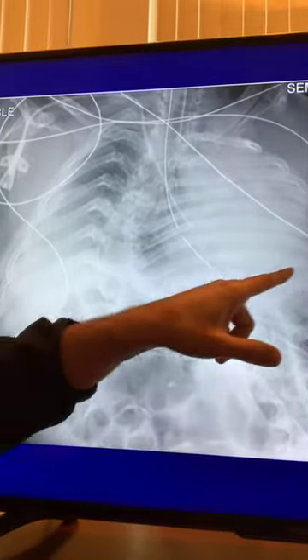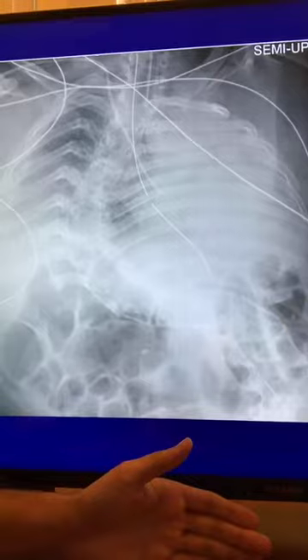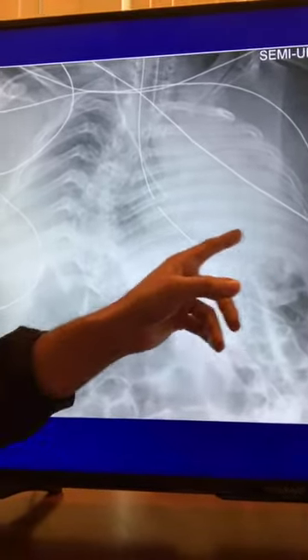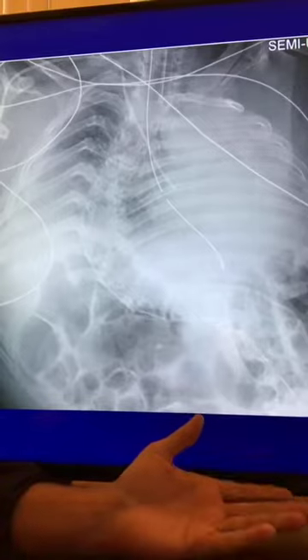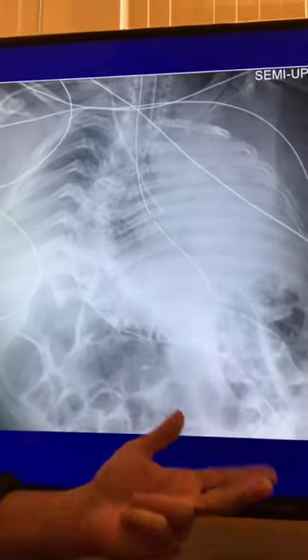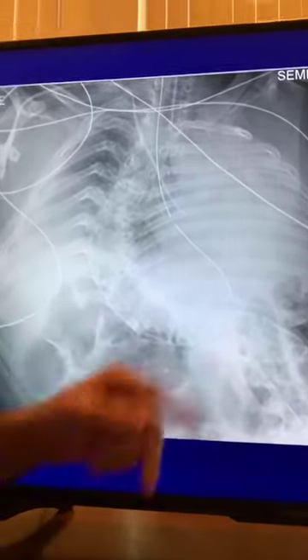There may be some pneumonia down here. Can I tell 100% for sure? No, I cannot. This is maybe a patient who's prone to aspiration, so there may be a little aspiration down here as well. This is a hard patient. And that's why sometimes we have to diff it out or give a differential. Yes, there may be aspiration. Yes, there may be pneumonia. And yes, there may be atelectasis. And likely there's a combination of all three in this area, all right?